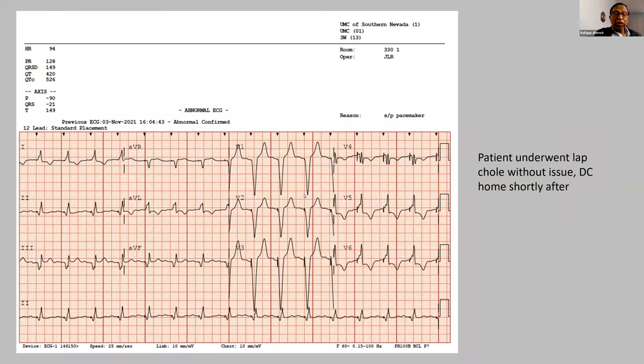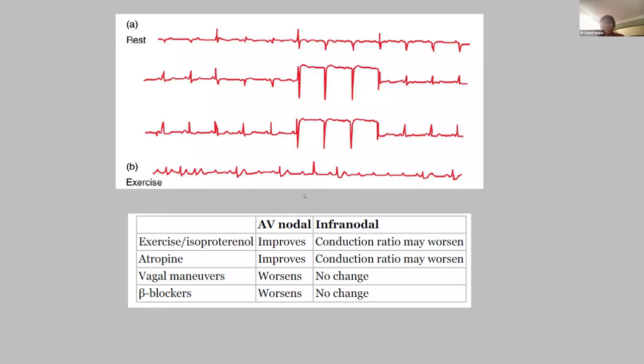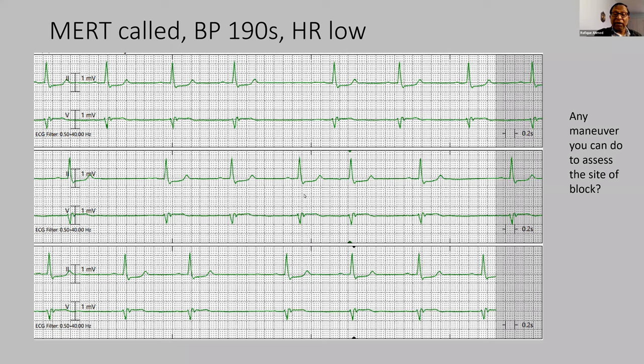So Hafiz, the patient got the pacemaker based on that indication? Is it a temporary pacemaker or permanent? Oh, it's a permanent pacemaker. Based on a nighttime bradycardia without history of syncope. But not during sleep. No, it doesn't matter, but at night, and there is no EP study done to prove a conduction problem, right? Well, I'm coming to that, Rafique Bhai. Okay, sure. All right. I'm coming to that. Echo is okay.